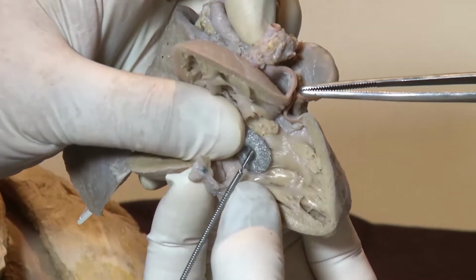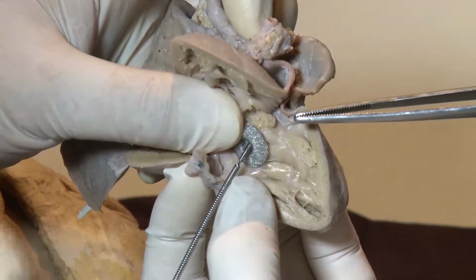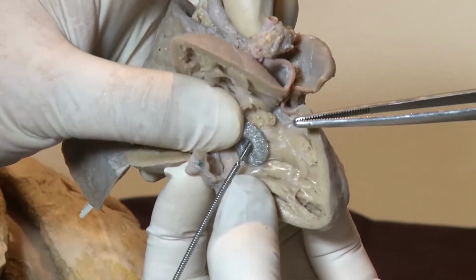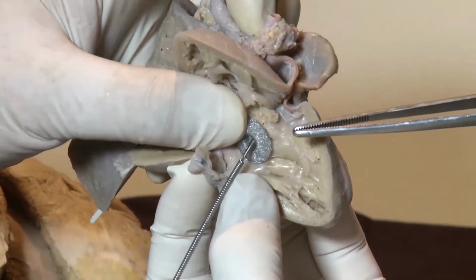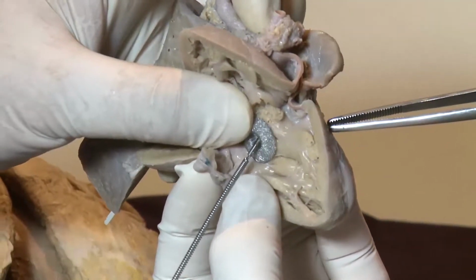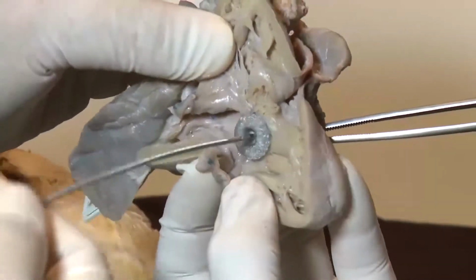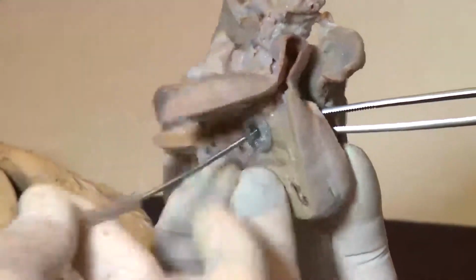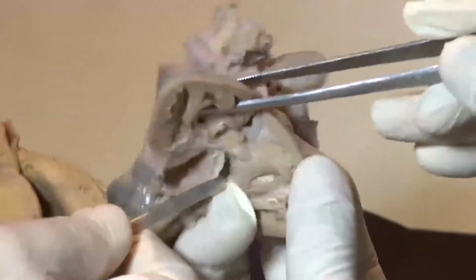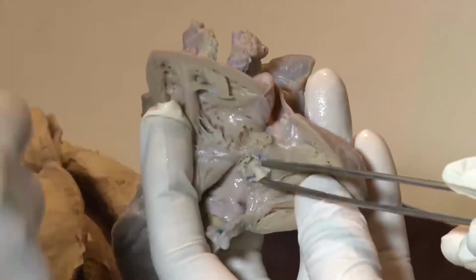So many doctors use steroids in case of AV block. It may be associated with the fibrotic change, so sometimes it works well. But the problem is recurrence. So I do not like this kind of device for closing a perimembranous VSD, because even though it's softer than the original Amplatzer, it may cause AV block.